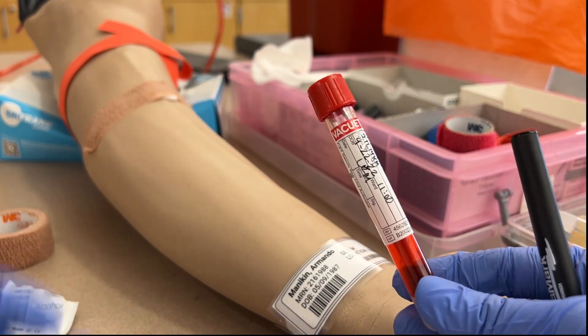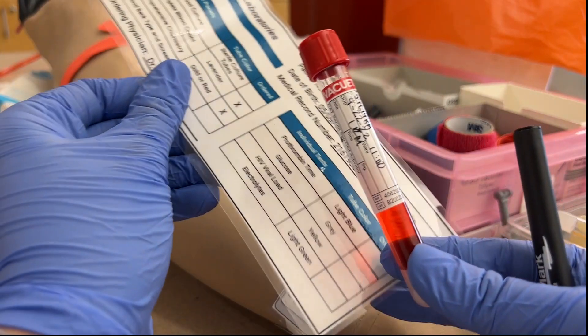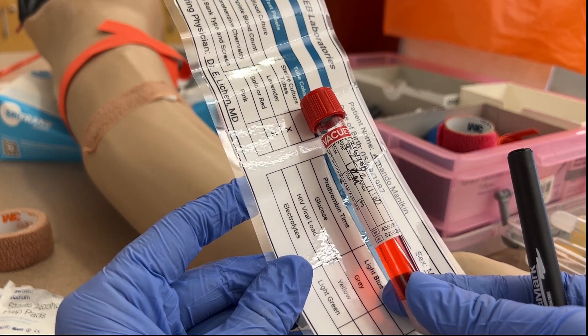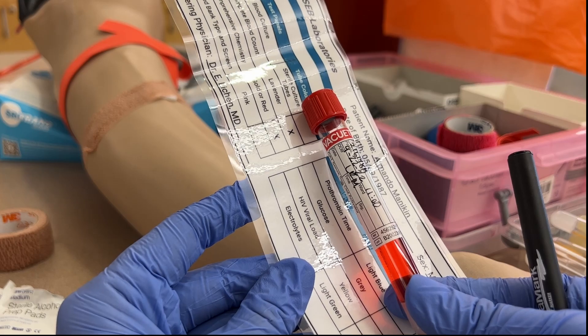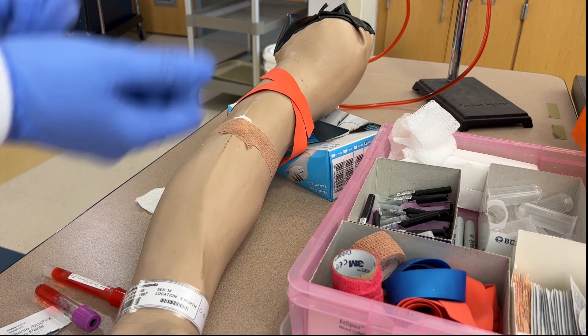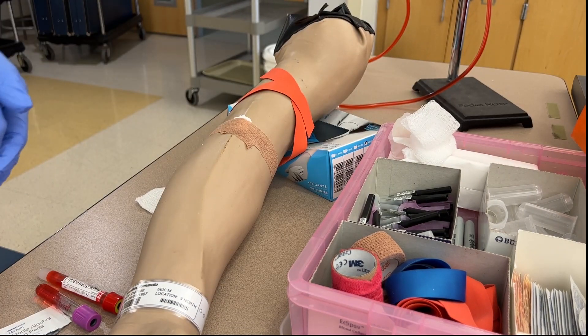Once the tubes are labeled, package them into a biohazard bag with the requisition slip and send them to the lab. The lab will then independently verify that the information on the label matches the requisition slip. Once you have sent the samples off, you can take off your gloves and wash your hands.